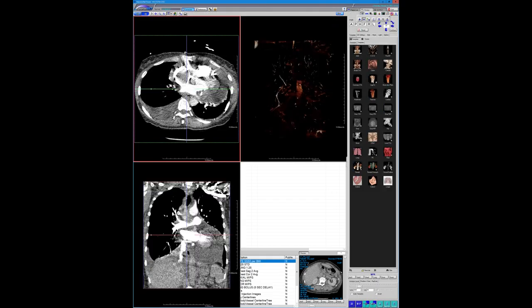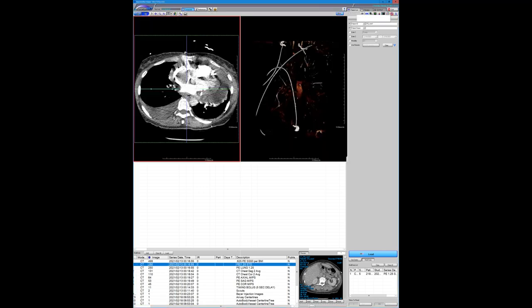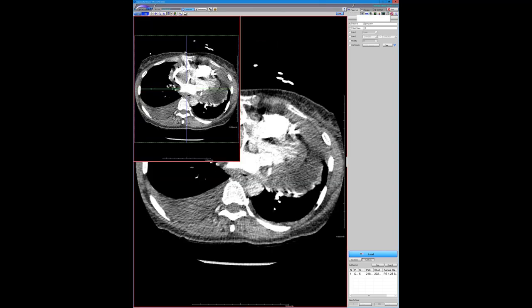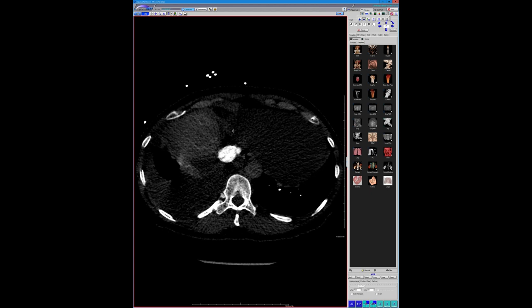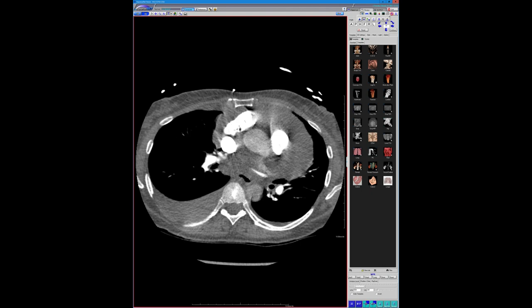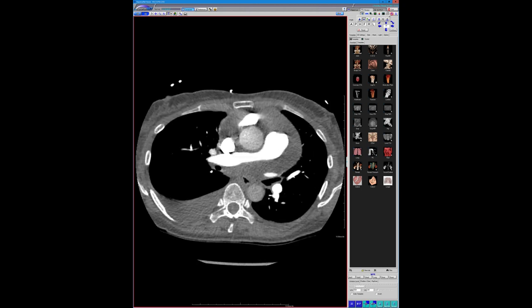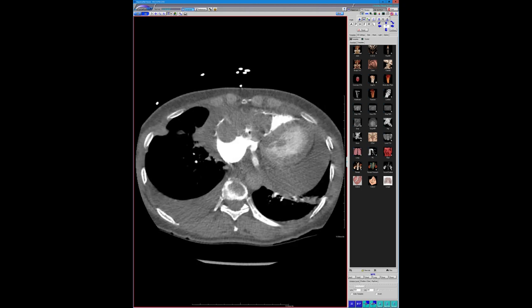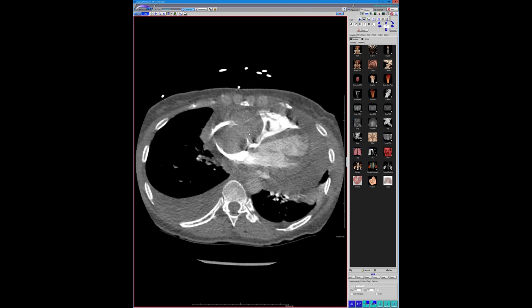This patient has a large pericardial effusion. The most conspicuous thing is this not-so-friendly-looking mass that's sitting in the right ventricle and right atrium — it's kind of prolapsing across the valve. The bulk of it is sitting in the right atrium. There's a good differential diagnosis when you just see this. There is a little bit of thickening of the RV wall here.